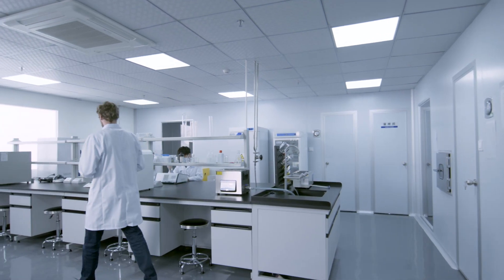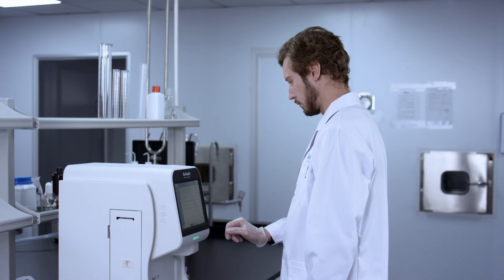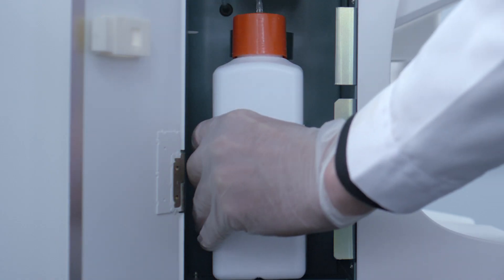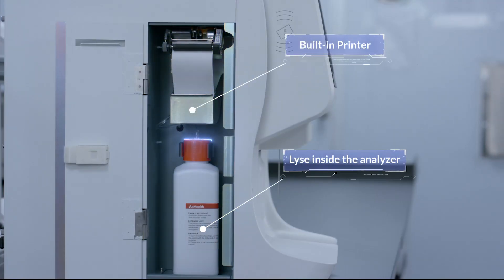In terms of functional design, AeC-3 has compact, space-saving and safety solutions, which can save space, avoiding biological contamination and less reagent consumption. There is a built-in printer above the device.